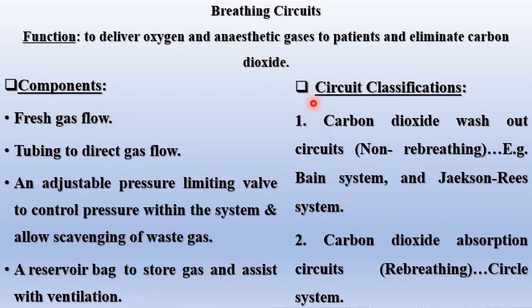Another type of circuits depend on soda lime, a material added to the circuit to absorb carbon dioxide. So it is carbon dioxide absorption circuits. The patient will rebreathe his expired gas. So it is a rebreathing circuit. It is a circle system.